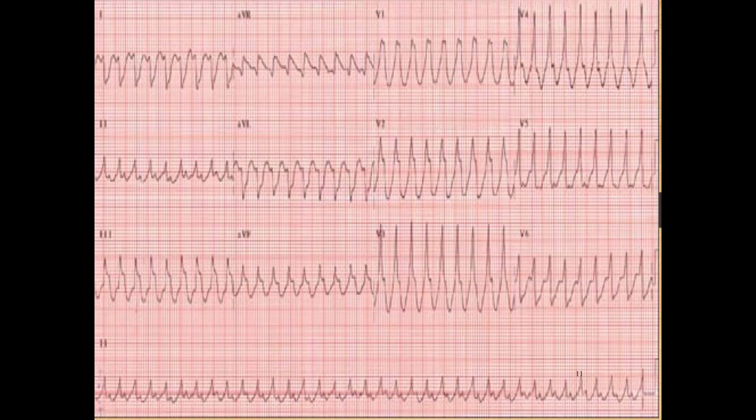So going through Brugada criteria, do I have precordial concordance? We don't, right? It's kind of negative, a little bit more negative-ish, a little bit more negative-ish. That's positive, positive, positive. That's a little bit more negative-ish. So we don't have concordance. That's fine. We can move on to the next one.